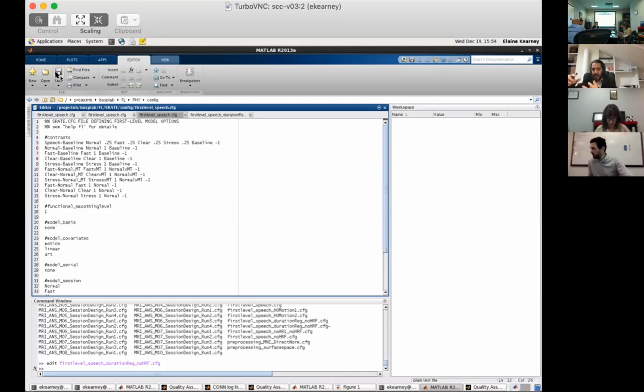So once the model figures out that relationship, it can control for that across the two conditions. Say we find a 5% level of activation across the two conditions we care about, but we only see an average duration difference of 1 second between them. Then those 5% BOLD signal changes might not be just an effect of the difference in duration between those two conditions. That's basically what the model can do for you.